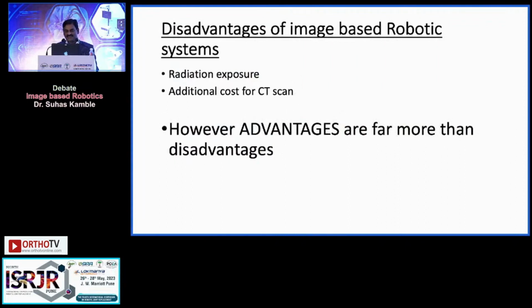However, there are some disadvantages of image-based robotic systems: radiation exposure and the additional cost of the CT scan. However, I think that the advantages are far more than the disadvantages.